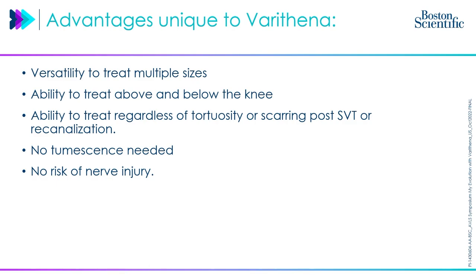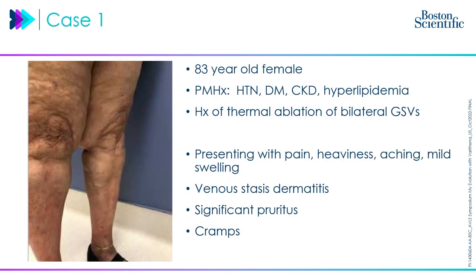Whereas with the micropuncture, you can do whatever you want. You can move the legs around. You can elevate them. That thing is going nowhere. And obviously, it's a really nice lumen to deliver the medication. The smaller the lumen, it's not the same. The larger the lumen of your access device, whether that's micropuncture or butterfly, the better the delivery is.